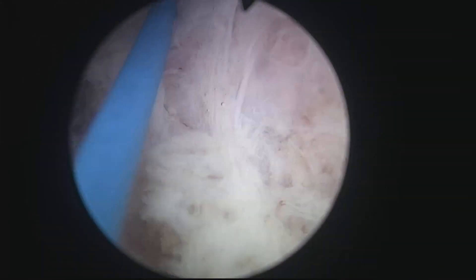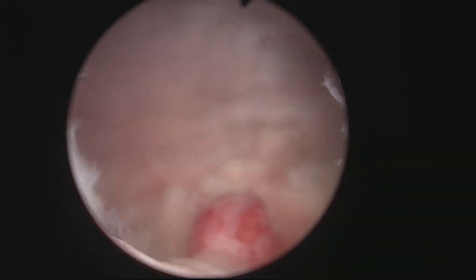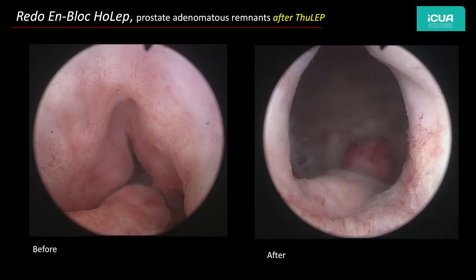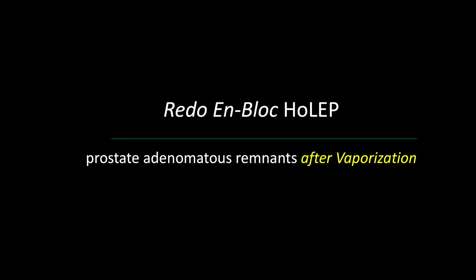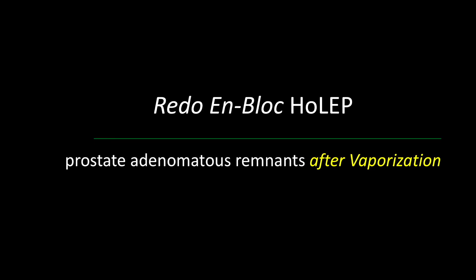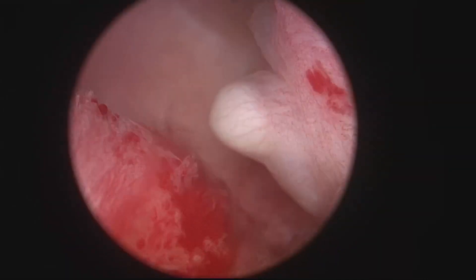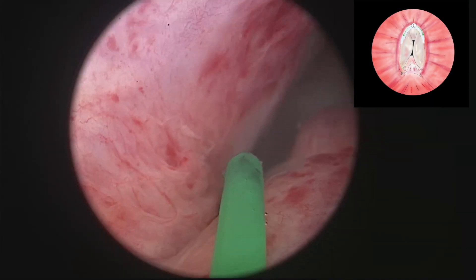As one can see after watching these videos, the apical preservation is amazing. The treatment is radical and definitive. It's very unlikely that these patients will ever need another operation. We present this last case where after vaporization of the prostate the patient still had bothersome symptoms, and again you see that over time when adenomatous tissue is left behind there is further growth.